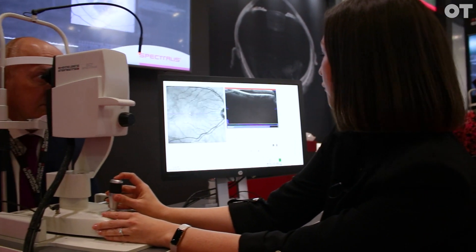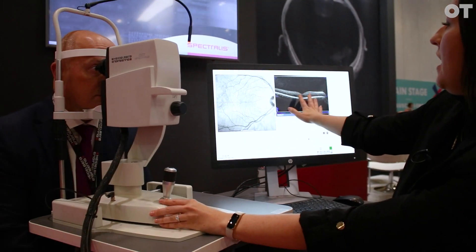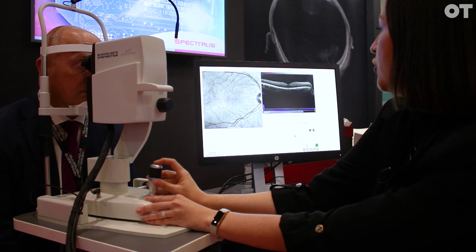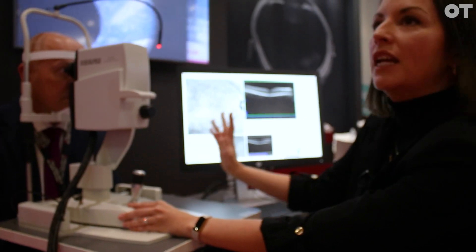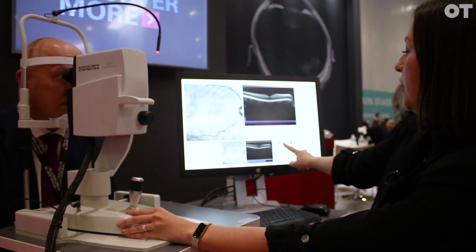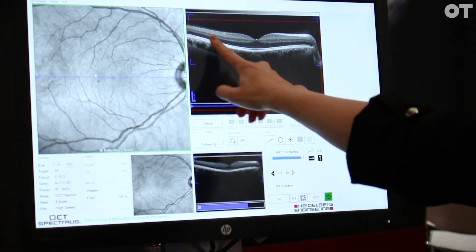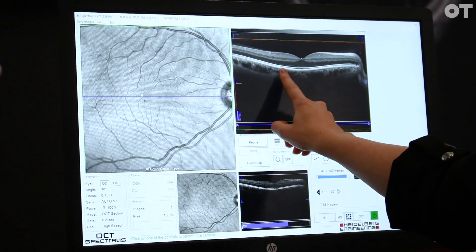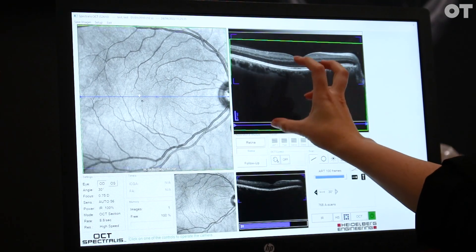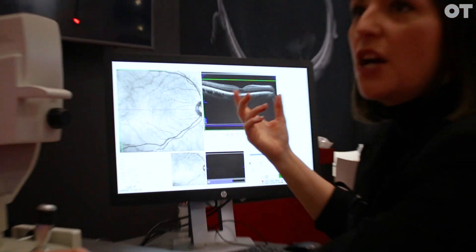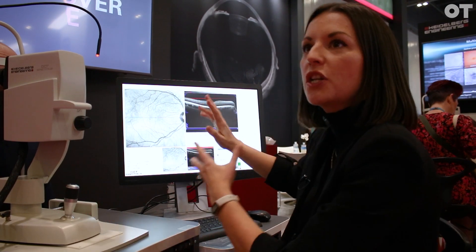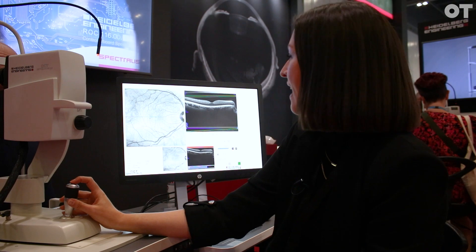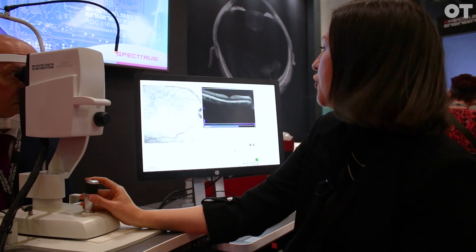It's really nice because it also enables us to build the image up to 100 frames. If I take the eye tracking off you can see the image is a little bit grainy — that's because it's just one frame. But when we engage the eye tracking and allow the image averaging to build up to 100 frames, we get really nice delineation of the retinal layers and a high-quality image, giving us more clinical confidence.